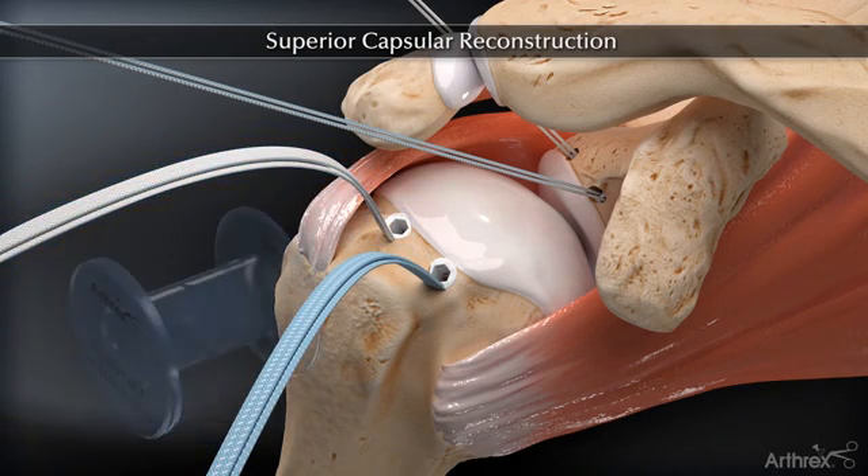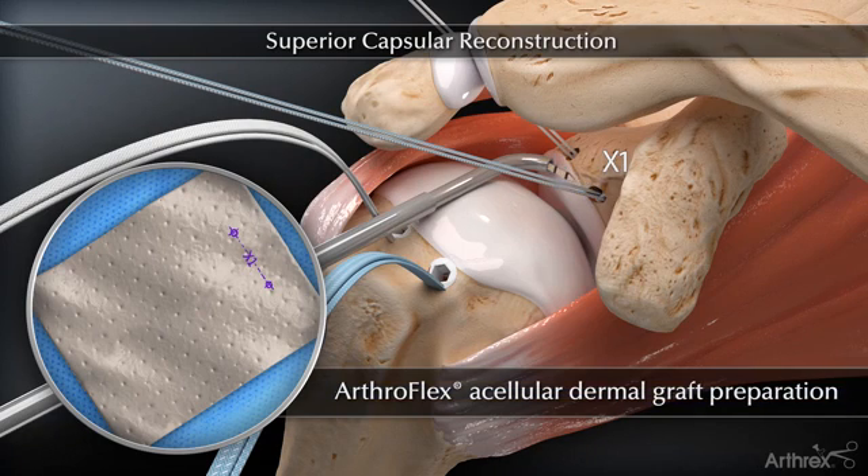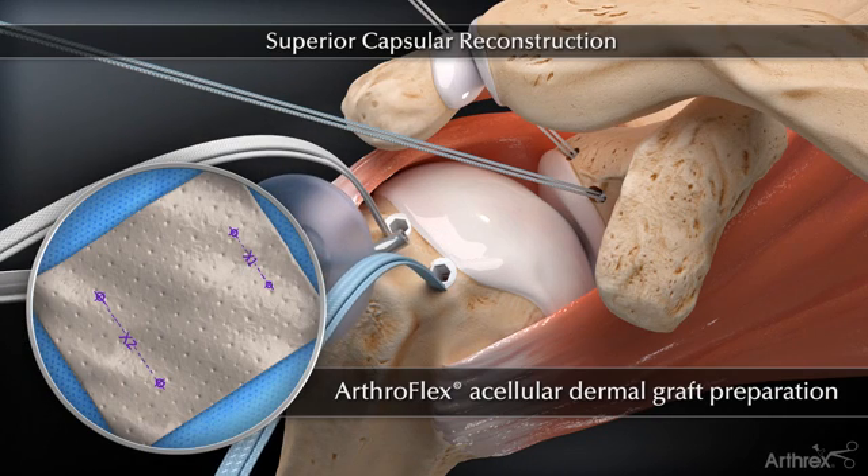A 10 mm passport cannula is used in the lateral portal to help with suture management and graft passage. An arthroscopic measuring probe is used to measure the distances between the anchors. These four measurements are recorded and used to shape the ArthroFlex graft.